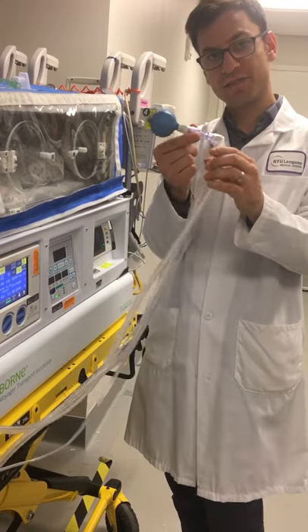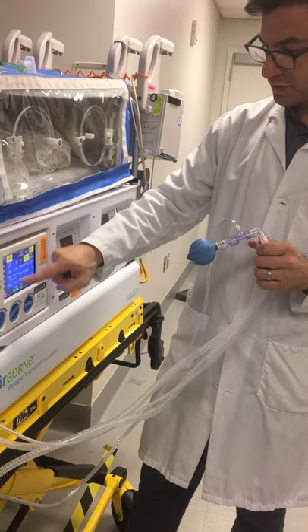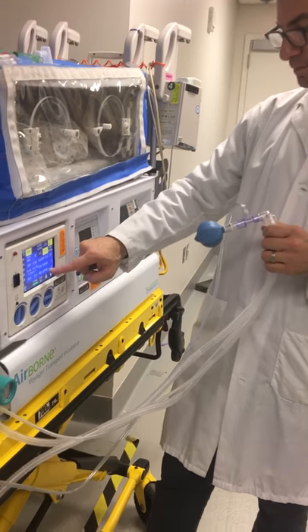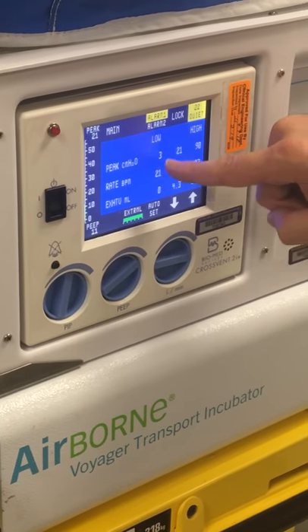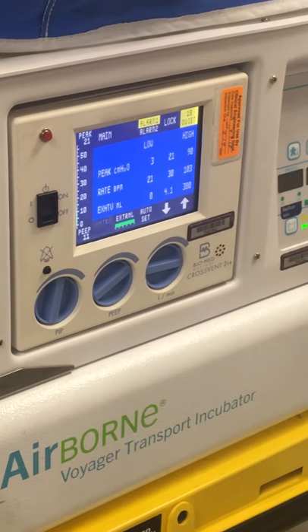We're talking invasive ventilation. We have an SIMV rate of 30, peak pressure of 20, PEEP of 10, flow of 8, and pressure support of 10. We'll talk about the alarms. Alarm 1: you have low and high settings for peak pressure, rate, and exhale tidal volume.